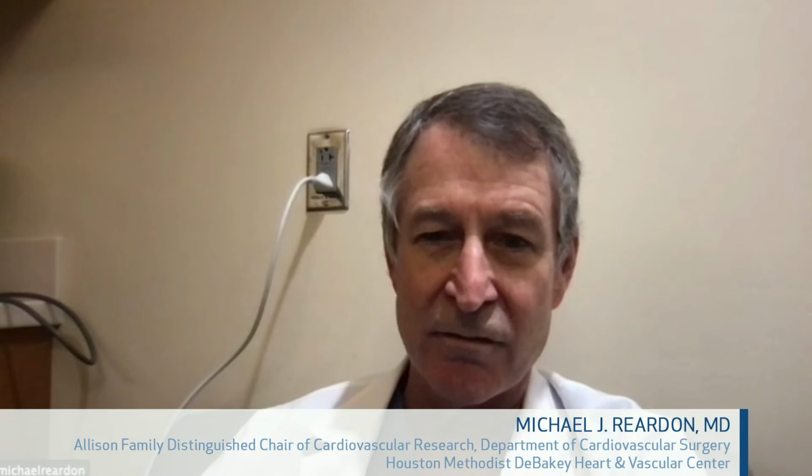So, can we operate on this lady? Yes, we can, but it would be a high surgical risk procedure. And certainly we would look very carefully for transcatheter approaches. As Neal has said, doing a transcatheter tricuspid valve-in-valve is easy. The complicating factor is that you have this lead there, and you don't want to trap that lead by putting a balloon expandable valve and then trapping that lead between that valve and the original surgical valve.